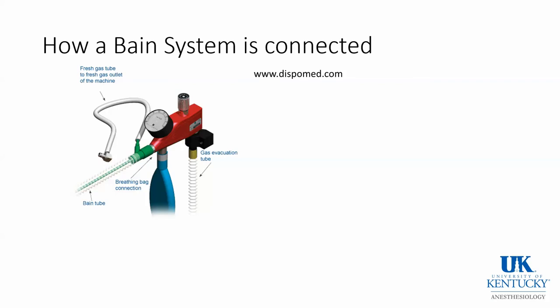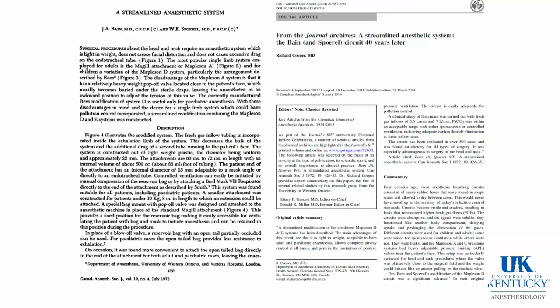There is an expiratory channel in the circuit, and expired gas could be collected and scavenged. The anesthesia provider could be the ventilator squeezing the bag, or the circuit could be connected to an anesthesia ventilator. It was a revolutionary advance in anesthesia care at the time because of the fact of it replacing heavy rubber tubes which absorbed agent and which were hard to clean and to sterilize.